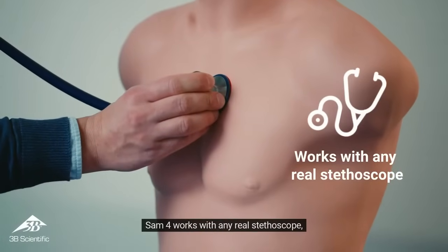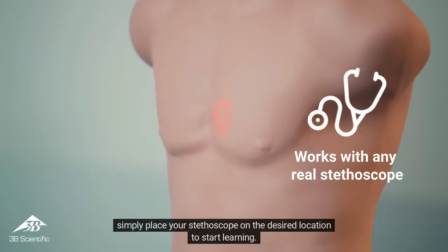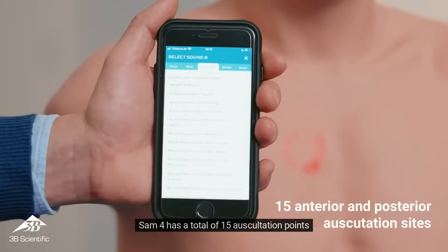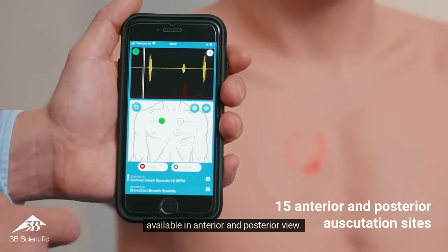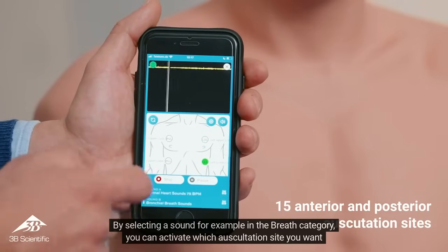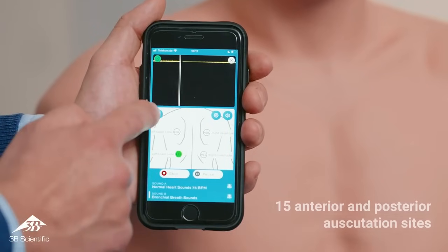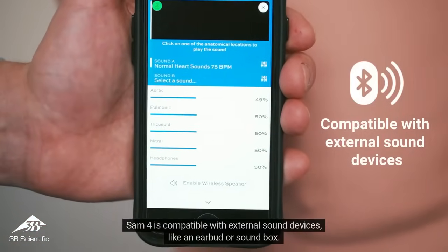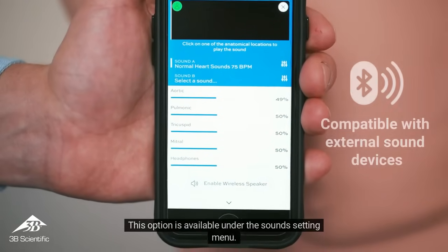SAM-4 works with any real stethoscope — simply place your stethoscope on the desired location to start learning. SAM-4 has a total of 15 auscultation points, available in anterior and posterior view. By selecting a sound, for example in the breath category, you can activate which auscultation site you want to highlight in the lungs. SAM-4 is also compatible with external sound devices like an earbud or soundbox, available under the sound settings menu.